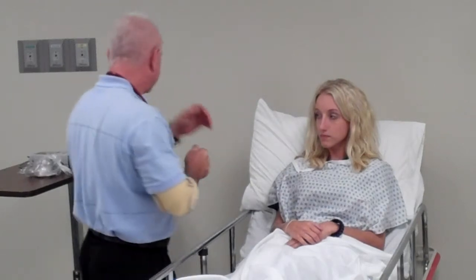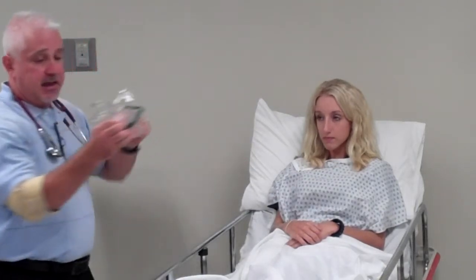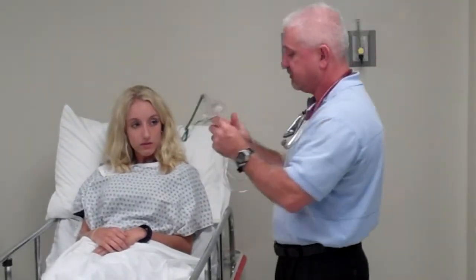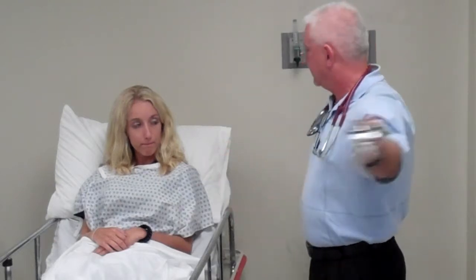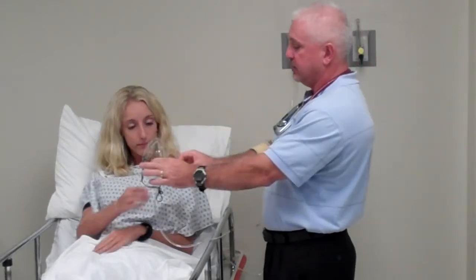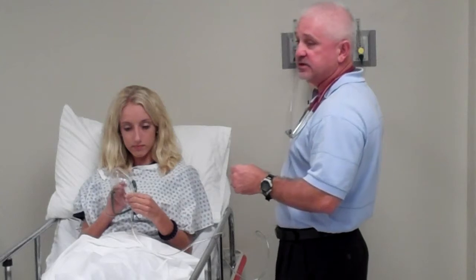I've already said I've checked her heart rate, respiratory rate, sat, color, and level of dyspnea, and I'm going to set up my oxygen device. It is a simple mask. It's one of the first of the reservoir masks. The simple mask will give an FiO2 range between 35 to 50%, and the flow range has to be between 5 to 10 liters per minute. I would let the patient feel what the oxygen mask is going to feel like and feel what the flow is. So a minimum of 5 liters is going to give me about 35%, and 10 liters, the high range, is 50%.